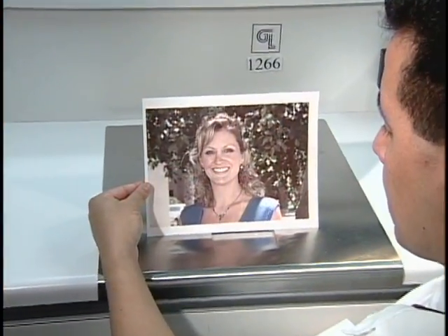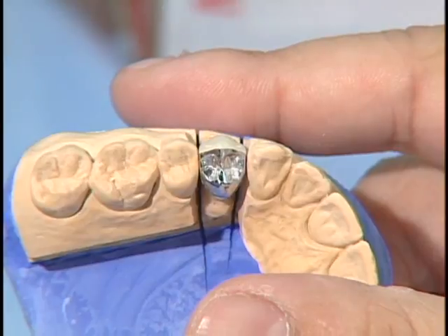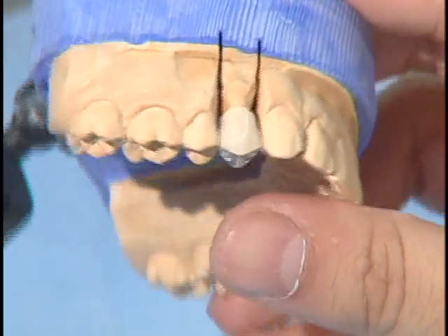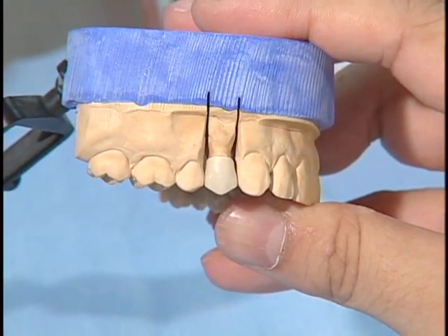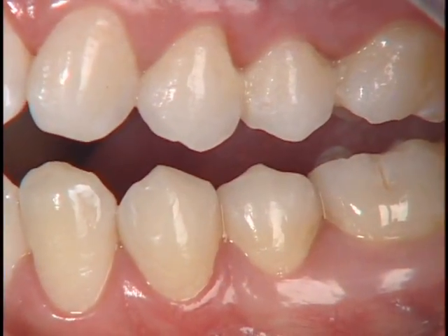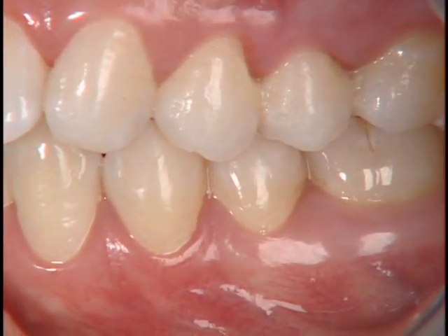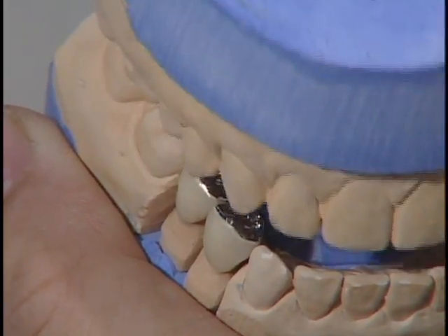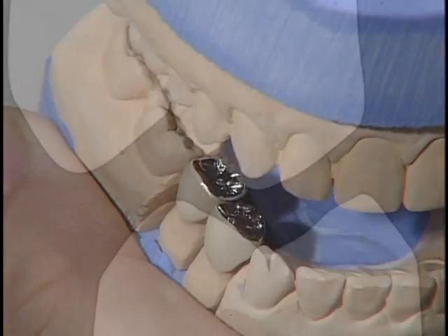So, when should the buccal cusp be included or excluded as part of the metal structure on a metal occlusal? The upper buccal cusps are visible in the buccal corridor, so for aesthetic reasons, we always exclude the buccal third of the upper buccal cusp from the metal structure. That's because porcelain facings will always look better without metal showing at the incisal. With lowers, however, the aesthetics aren't really a concern because once the bite is closed, you can't see the buccal cusp. Therefore, for purely functional reasons, the buccal cusps on lowers are included in the metal substructure.